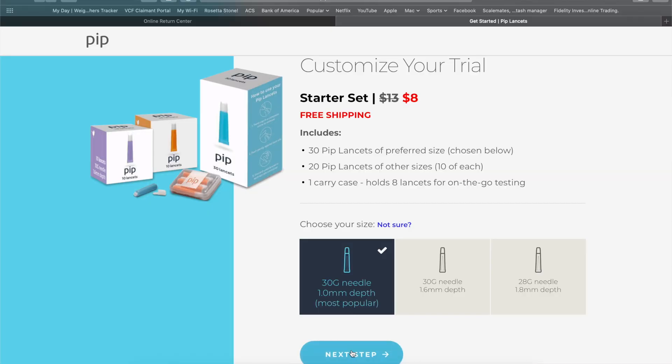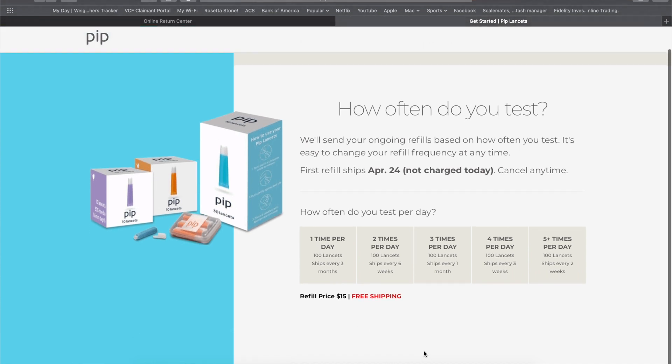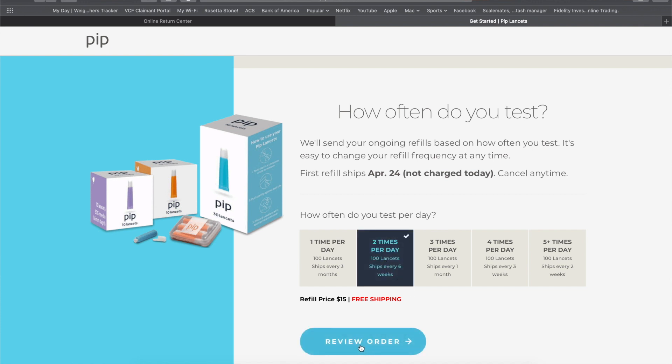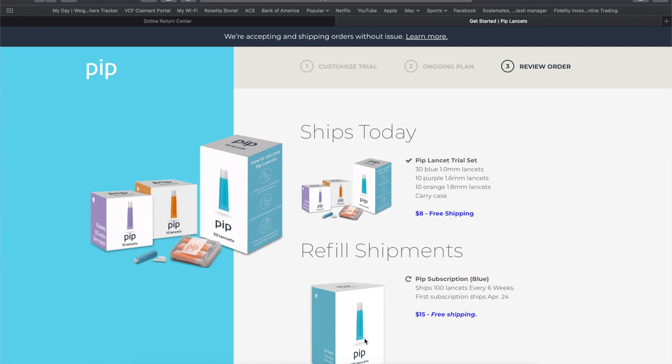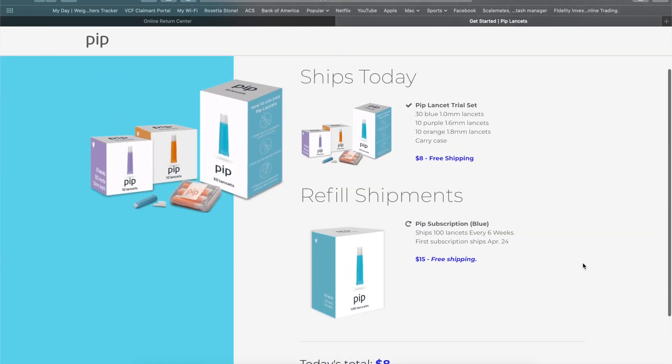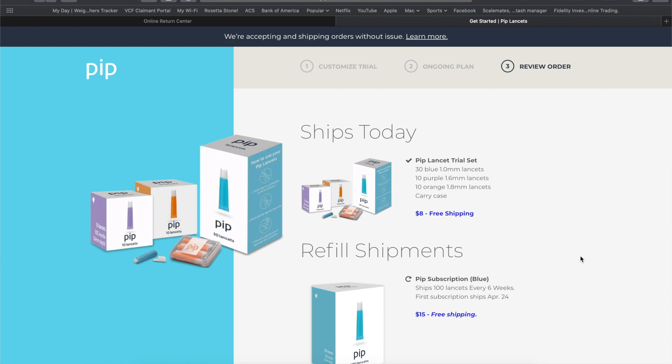After setting up your starter set, you'll then determine how often you test your sugar in a day, anywhere from 1 to 5 times per day. Based on that, PIP will then send you refills to make sure that you never run out. The refills run $15 for one refill set, which is 100 lancets. It's important to know this is a subscription service, and as long as you continue the subscription, PIP will be sending you lancets. If you decide that PIP isn't for you, make sure you cancel your subscription. For those of you who hate subscription services, you may not want to consider PIP, because this is the only way they function.